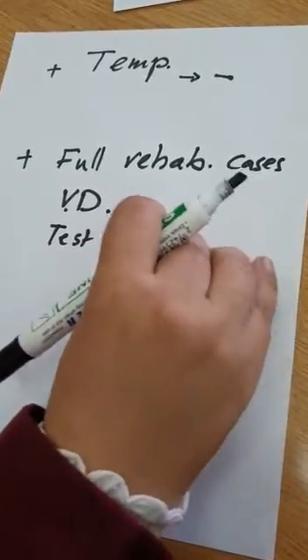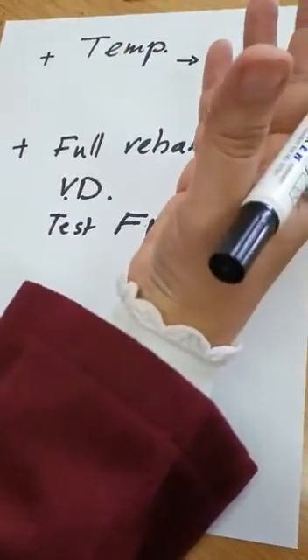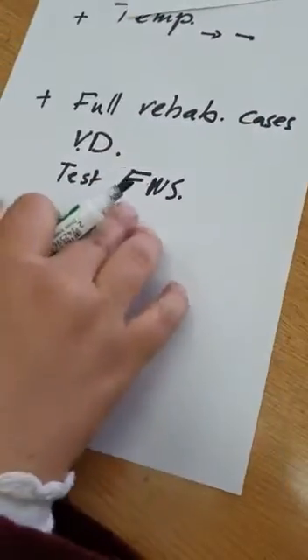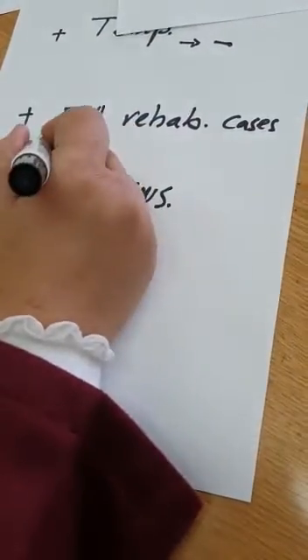So the mock-up will not only be over the anterior teeth where I'm making my veneers, it could also extend over the occlusal surfaces of posterior teeth to check and see if the vertical dimension I'm recommending is sufficient. I test the freeway space by speech and by vertical dimension measurements, and check whether this is sufficient or not. So the mock-up material can help me in cases of increasing vertical dimension and reducing the freeway space, and we'll test whether this is enough or not.